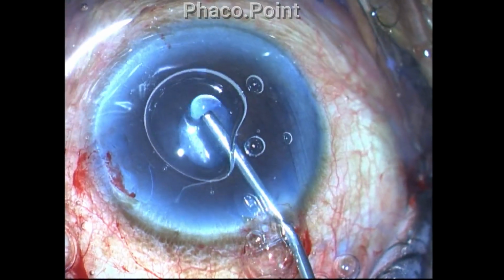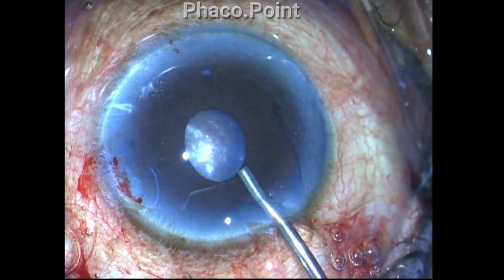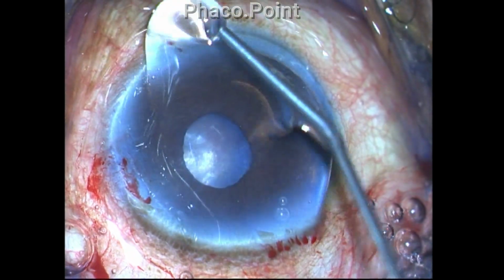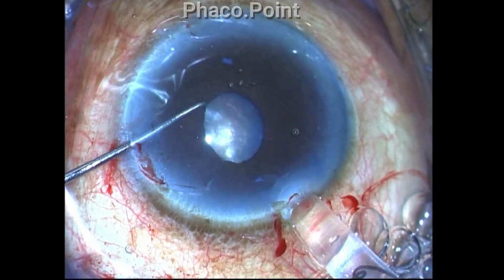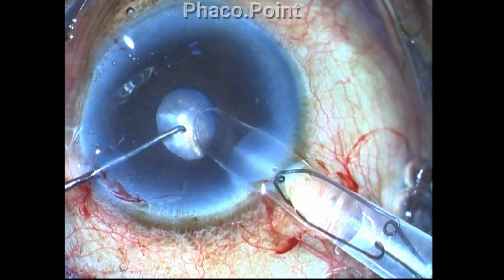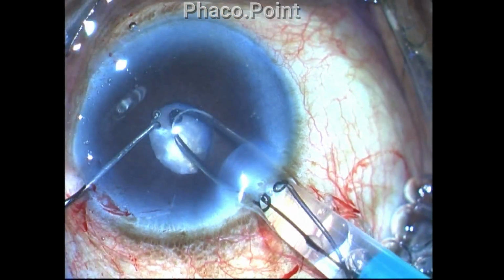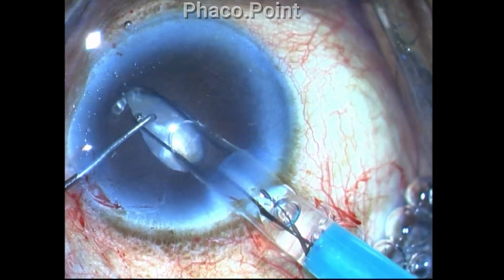So I first inject viscoelastic into the anterior chamber. By now the Descemet membrane detachment had completely settled. So I then committed myself to continuing with this case, and the first step is to use pupil dilating devices. Normally in a pupil which is of this size, I would do a pupillary stretch to eliminate sphincter sclerosis of the pupil before injecting the ring.